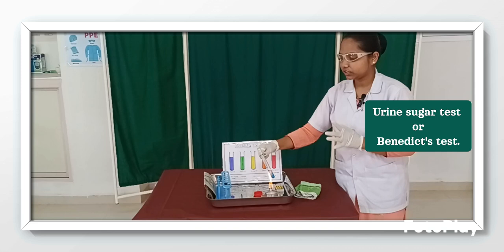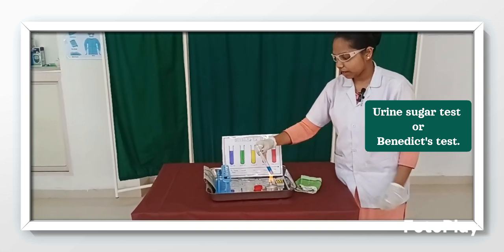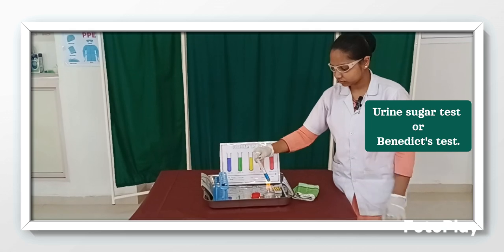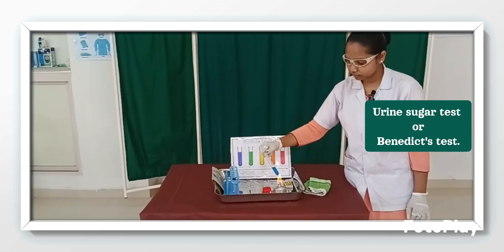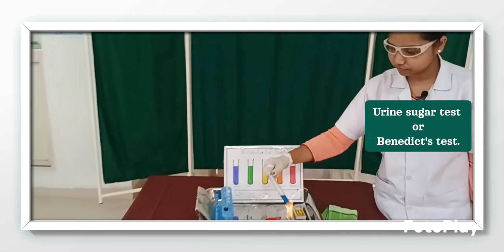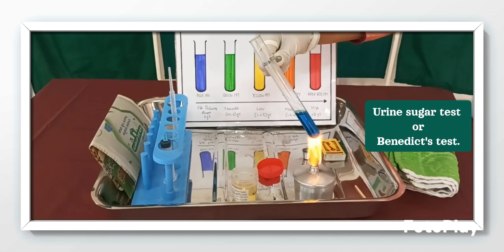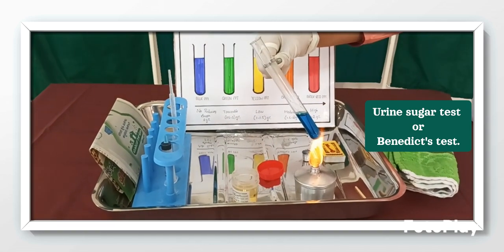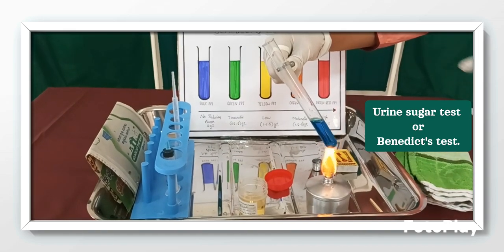The test tube mouth should be away from the face. We have to heat till it is boiling. Here the bubbles are appearing, which means it is boiling.